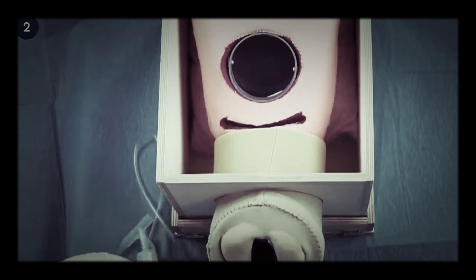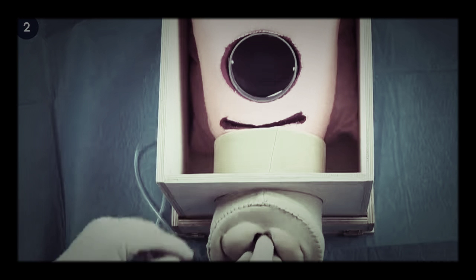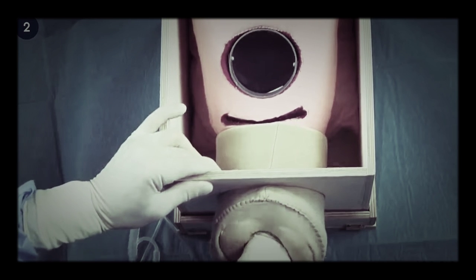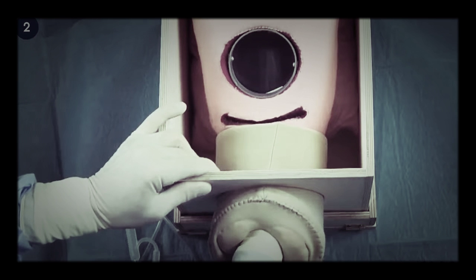The Bakri balloon is inserted into the uterine cavity by inserting the hand into the vagina and reaching up to the uterus. Care should be taken to insert the entire balloon past the cervical canal and internal ostium.